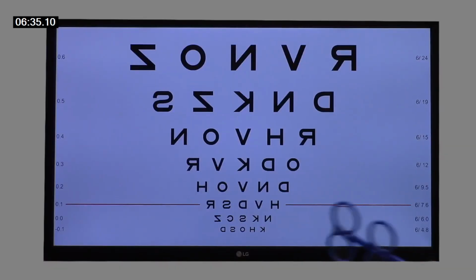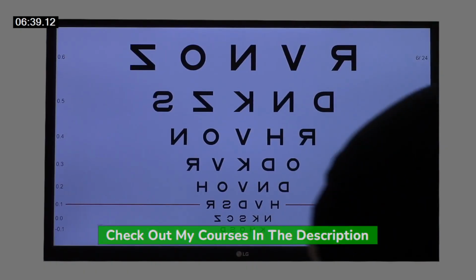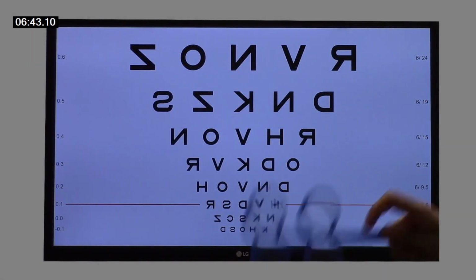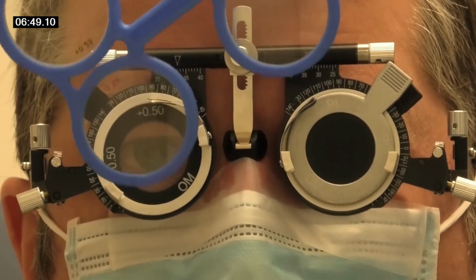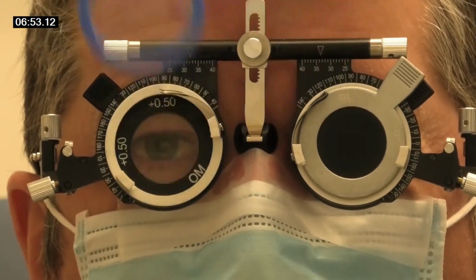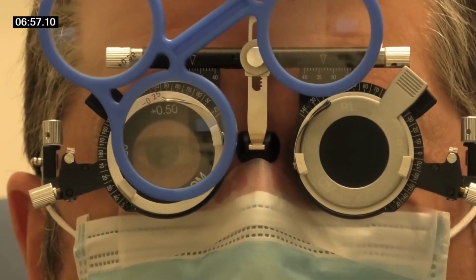So just looking at the S over here, is it clearer with lens 1? It is. Is it clearer? It's a little bit clearer. Worse or about the same? Can you take it away and put it back in front? So the S, yeah, on the front. Yeah, I think it's a bit clearer.